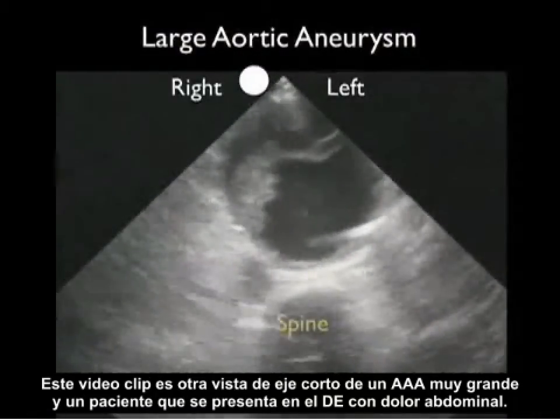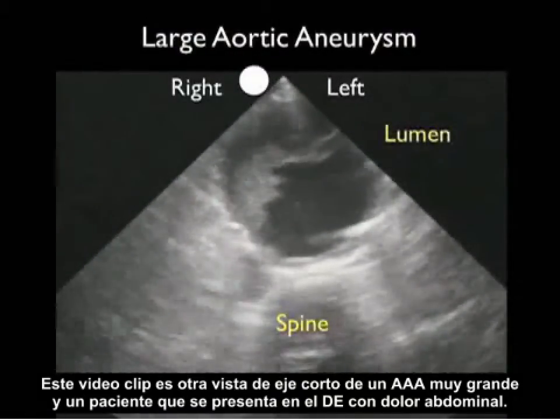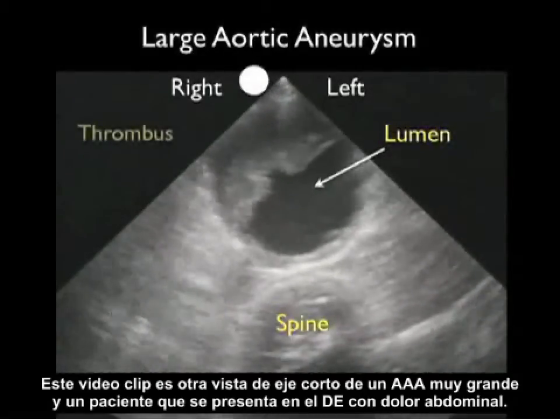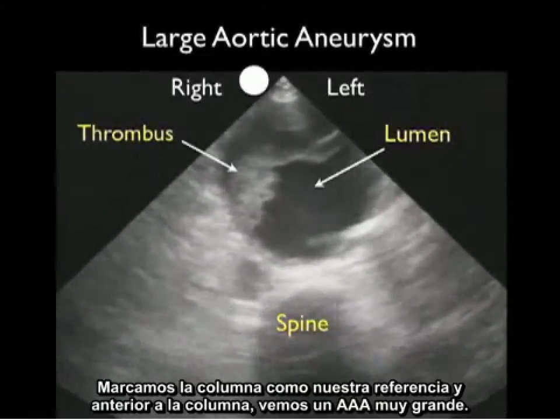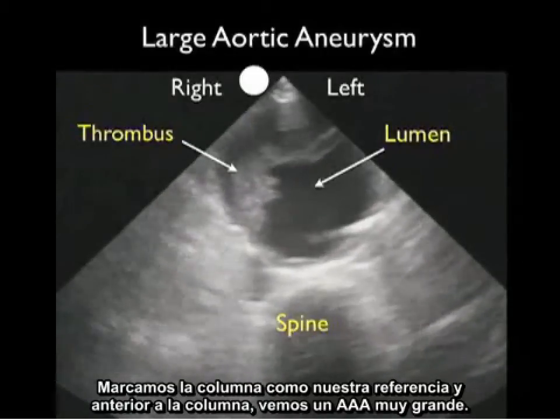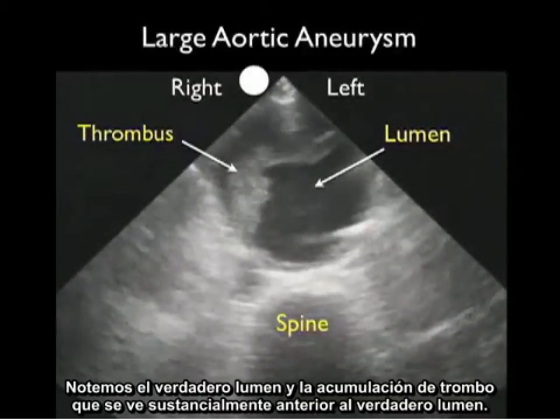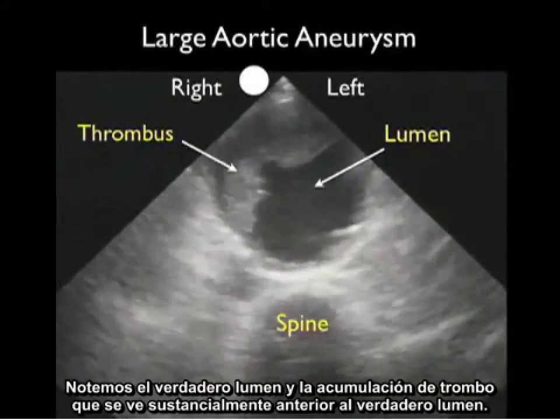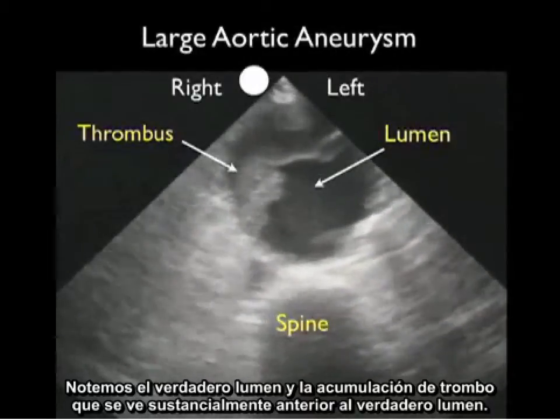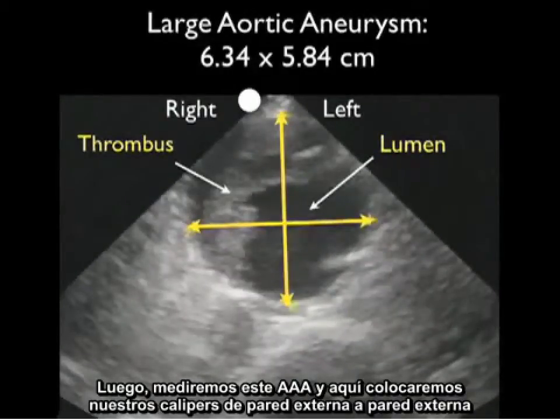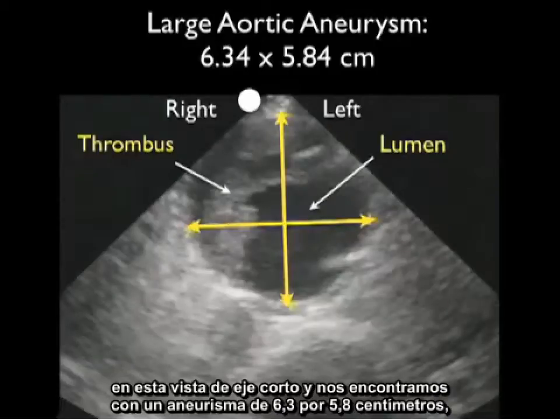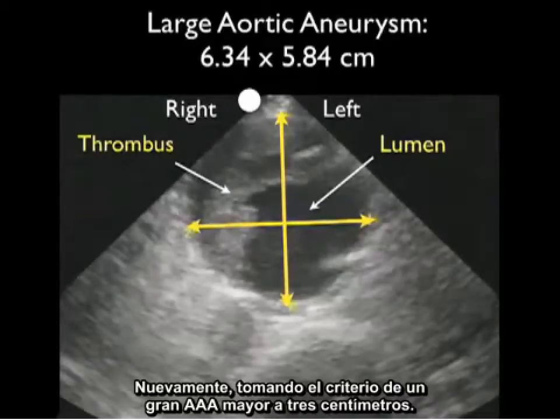This video clip shows another short axis orientation of a large AAA in a patient presenting to the ED with abdominal pain. With the spine marked as our landmark, we see a very large AAA anterior to the spine with a true lumen and substantial accumulation of thrombus anteriorly. Placing calipers from outer wall to outer wall in short axis configuration gives a measurement of 6.3 by 5.8 centimeters, meeting the criteria of a large AAA greater than 3 centimeters.